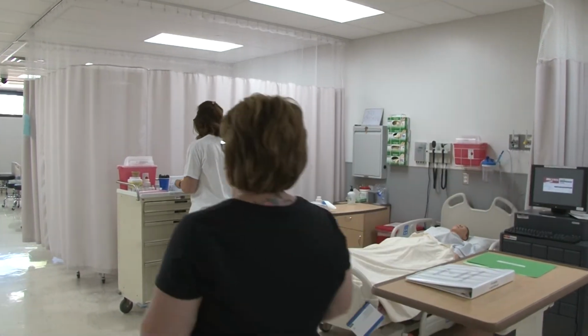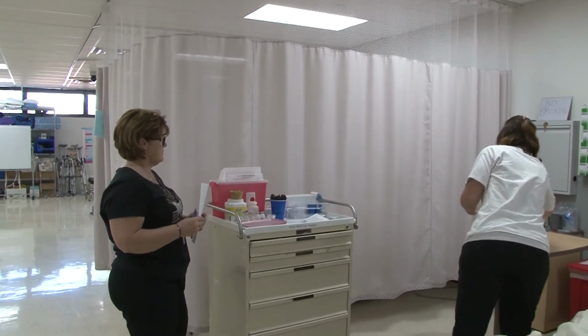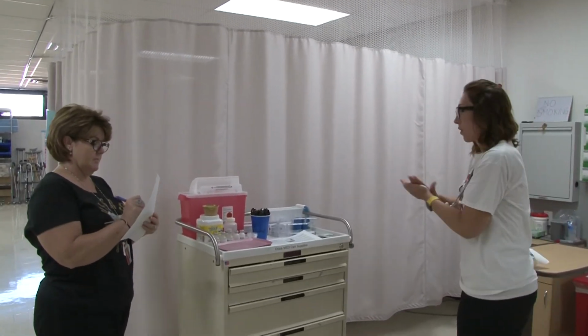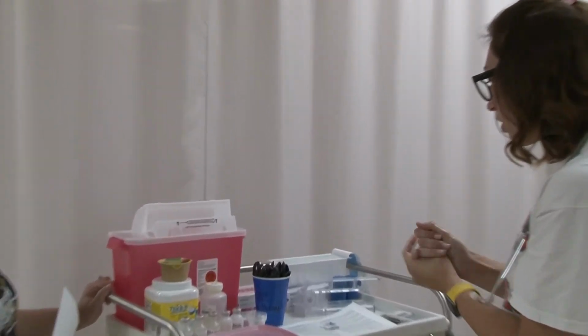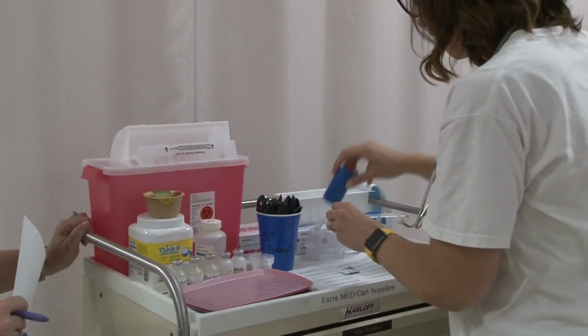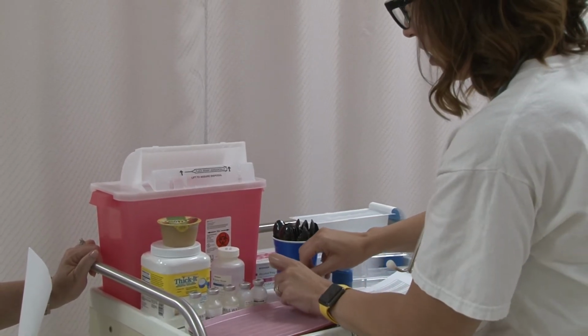And I'm going to come over here to prepare my medications. I'm going to get some hand sanitizer. Okay. So both of these I'm going to have to cut in half. So I'm going to use my pill cutter here. And I'm going to get a little cup.